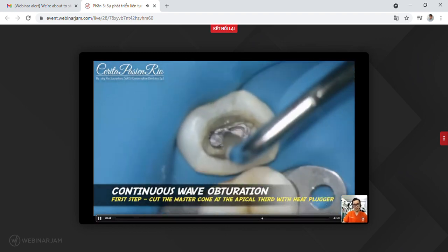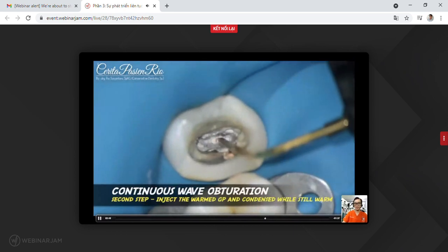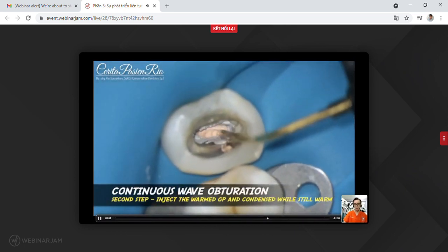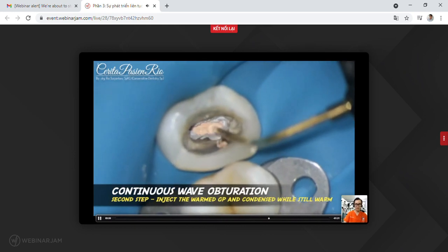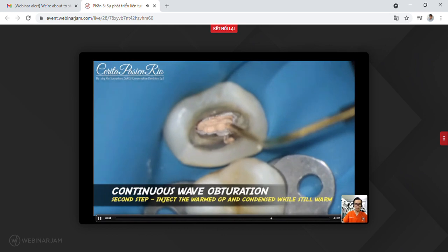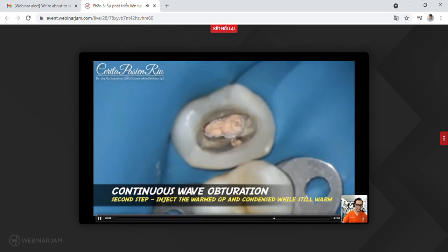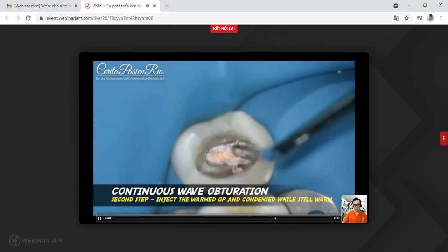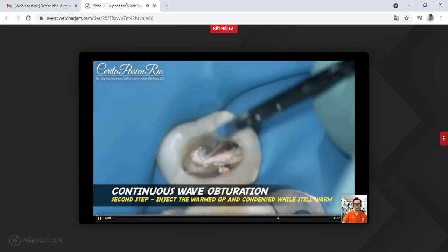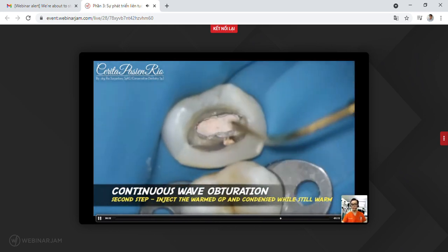So from 2016, I always use bioceramic sealers. Maybe in the future I will explain more about obturation, but now we have a lack of time. We have reached 90 minutes. So I hope that this case will be our closing case report before we go through our question and answer session. And this is how I filled the canal.